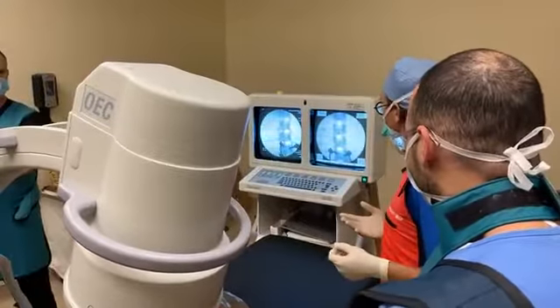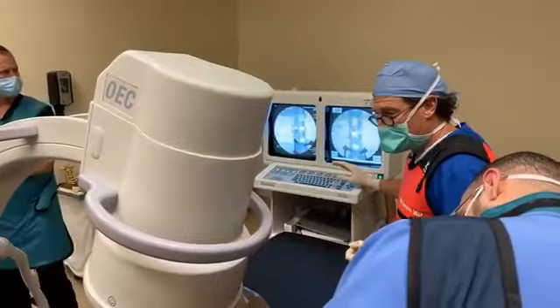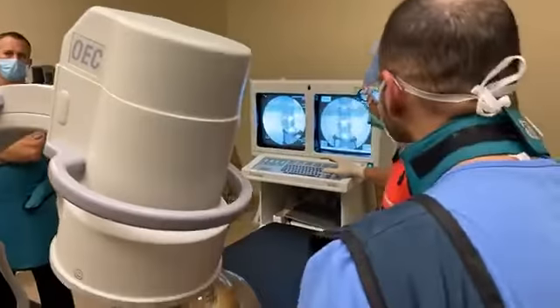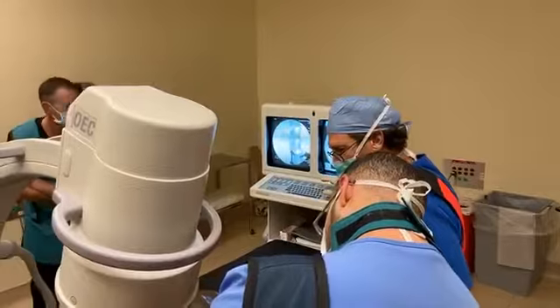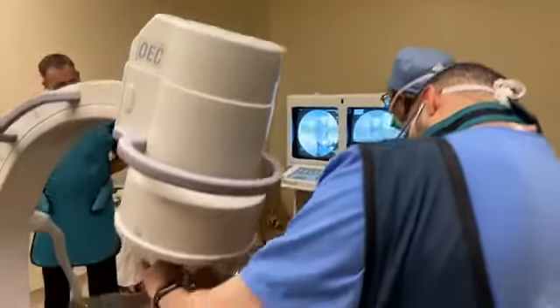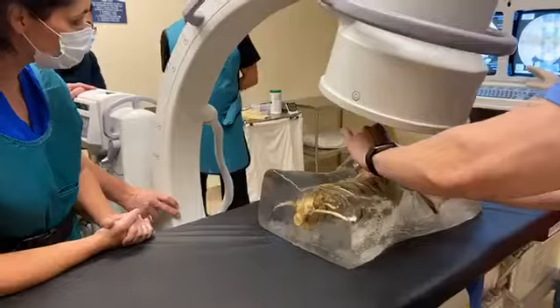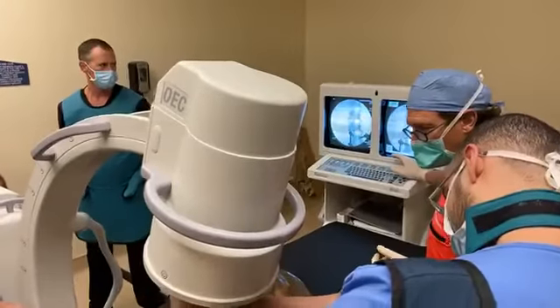Perfect. So the needle needs to go up a little bit, so docking notch to the feet. Good. And push. Perfect. Nice. Keep going. Nice. Now docking notch toward you, so it tends to go medial. Good. Perfect. Now go to bone.